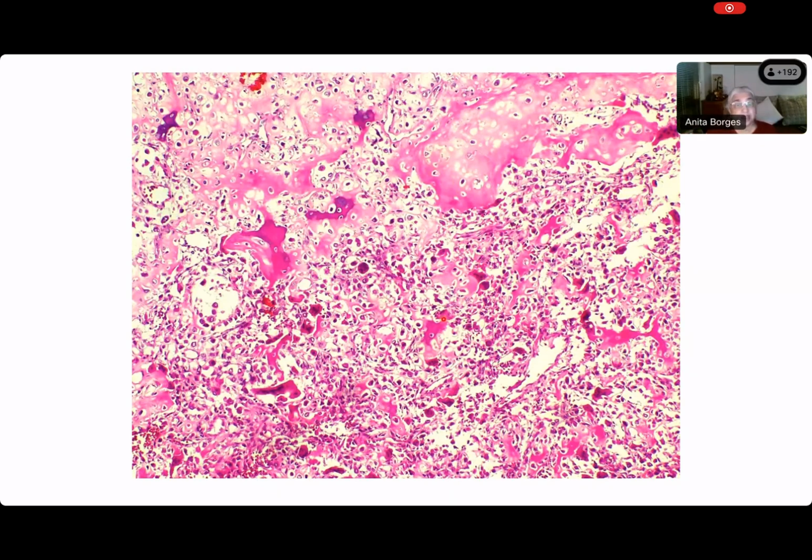Now, do you see anything else, Sarangi, that you want to remark on? Giant cells. Giant cells, okay. But what is happening in the whole of this? We're only talking about this, but what about all this? What are the cells like? There is an increased number of cells. This is a very cellular part of the tumor, right? Yes. It's hugely cellular, and not only that, there is a good deal of pleomorphism over here. Certainly, this is not a monomorphic tumor with just a mild variation in nuclear shape and size, as well as cytoplasmic shape and size, right?